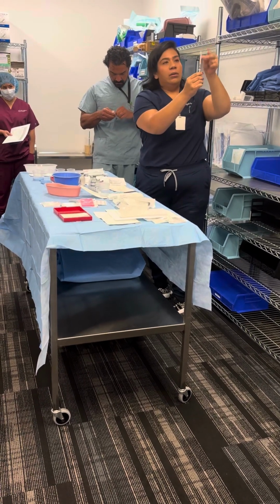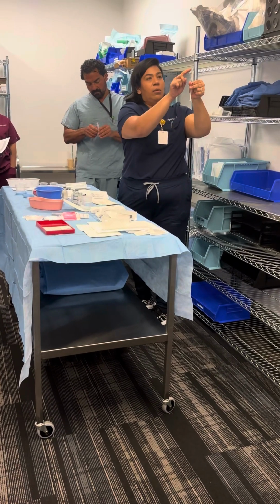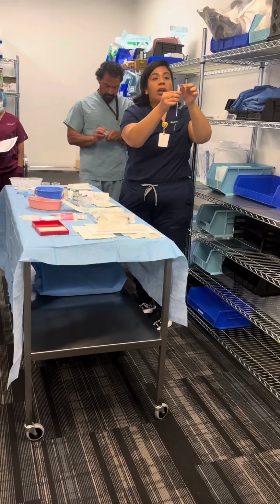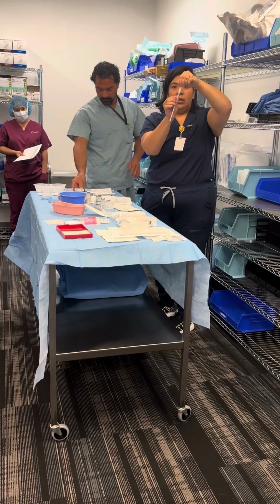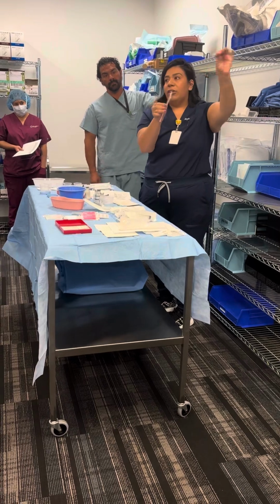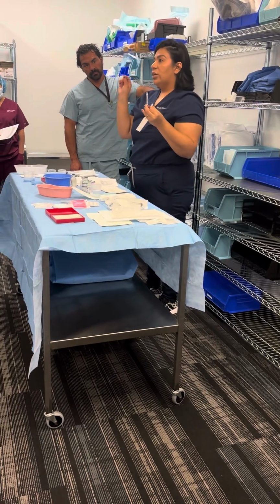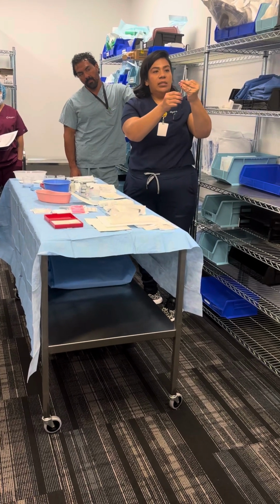Did you guys see that? Yeah. Okay. I'm gonna flick it a little bit. Some's coming out, which is actually a lot for the eye, so I might bring it back down and push it back up. I'm gonna not shoot out here. I'm gonna put this hypo on top, and then I'm just gonna take this off so I can see exactly. Eyes are very specific and tiny, so I wanna make sure that it is primed, because you don't wanna inject air into the eye, okay? So that's primed. I can see some is coming out already.